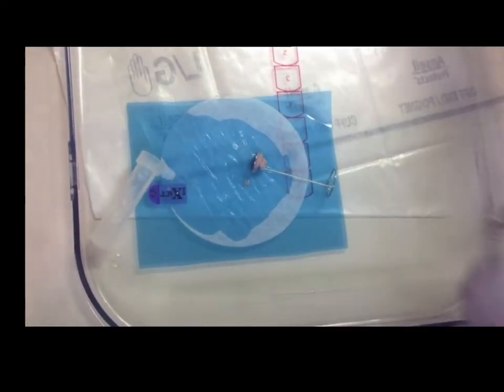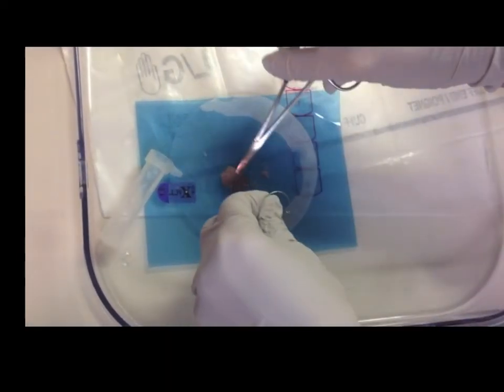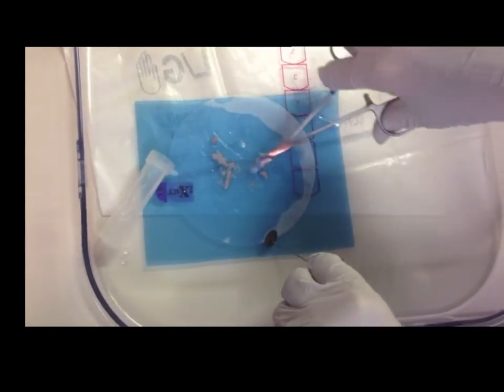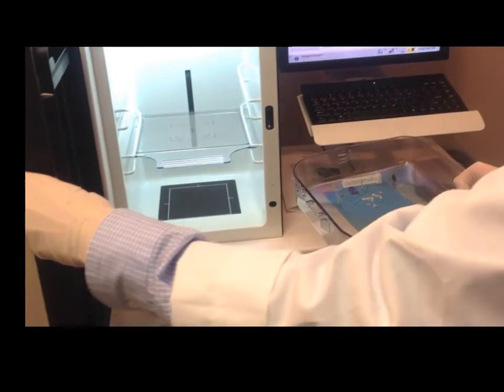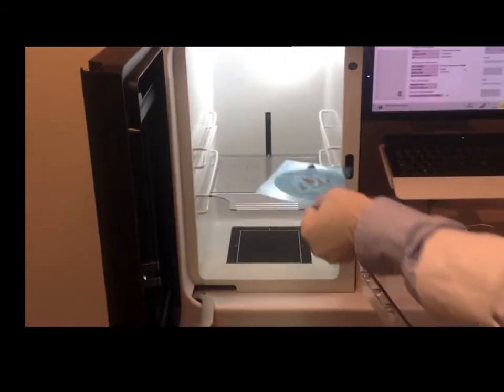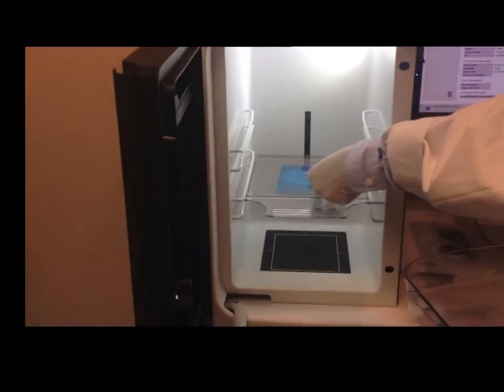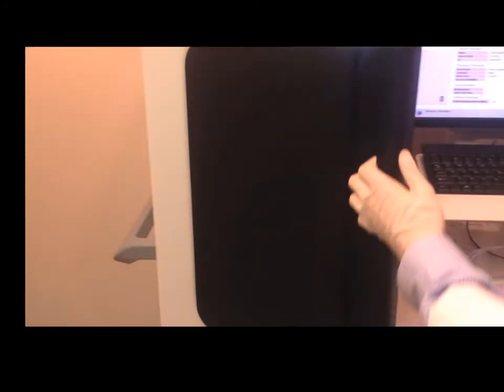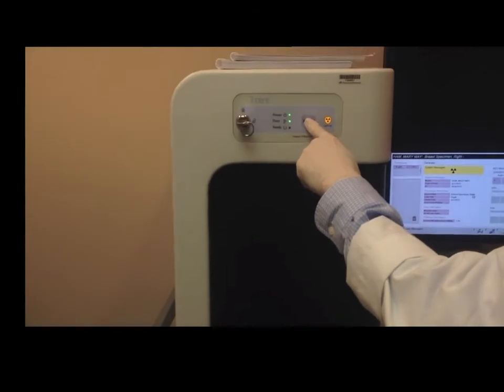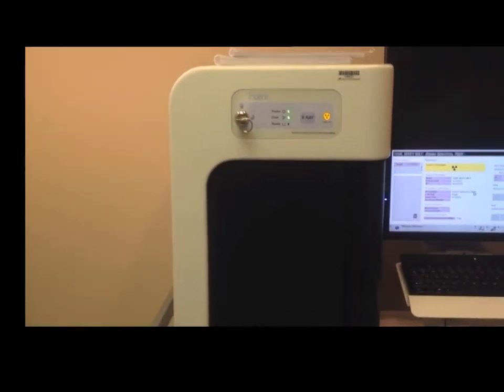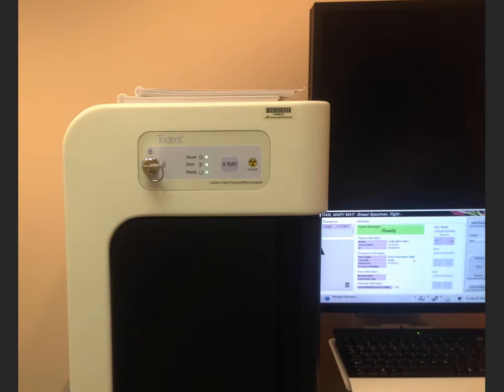Use mosquito forceps to spread your specimens out on the wet filter paper and then radiograph them using a conventional mammographic unit on magnification setting or in a specimen unit as shown here. We use the trident specimen unit for our specimen radiographs. It's very nice to put the specimen in and then you just press this x-ray button until it beeps. Before you start you always just want to check that the correct patient identification is up on the attached computer screen.